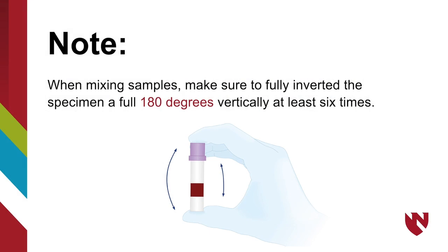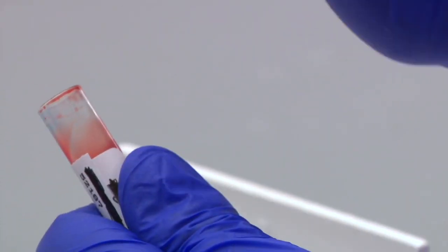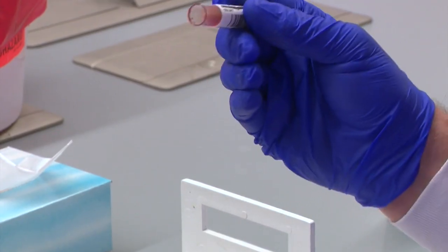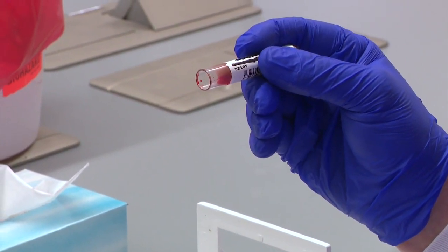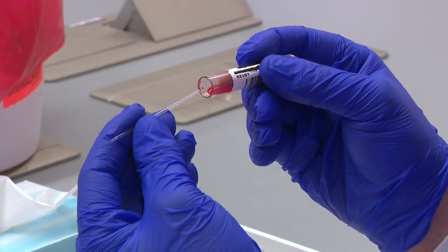Mix the EDTA blood specimen by tilting the tube approximately six times before taking the blood sample. This will allow for adequate cell suspension. Remove the cap with the tube facing away from you.